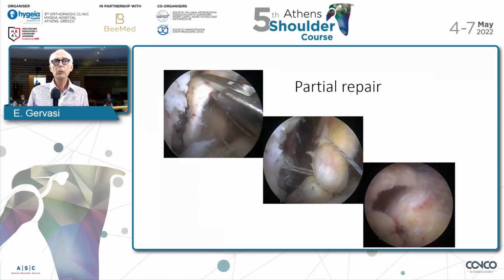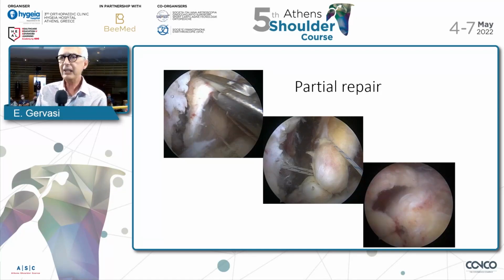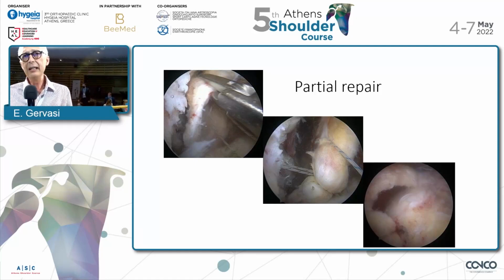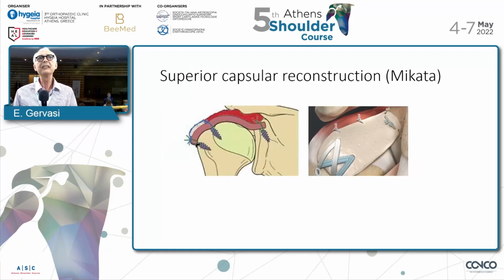So, which alternatives to the balloon? This is the partial repair. The partial repair is a very effective procedure when we have some muscle. When we don't, we do not have a tenodesis effect that can work properly. But partial repair is an alternative.